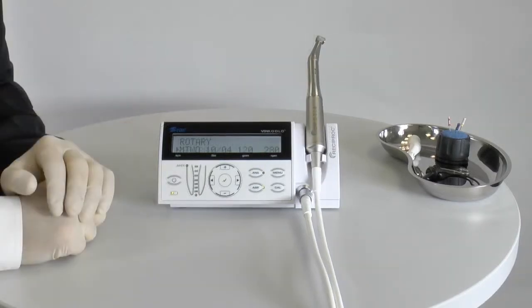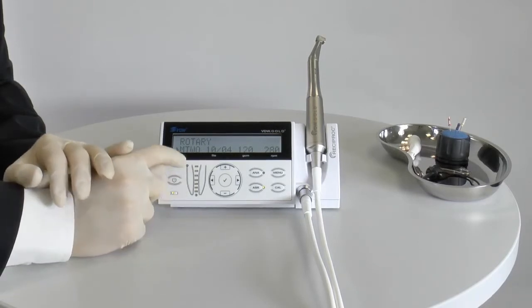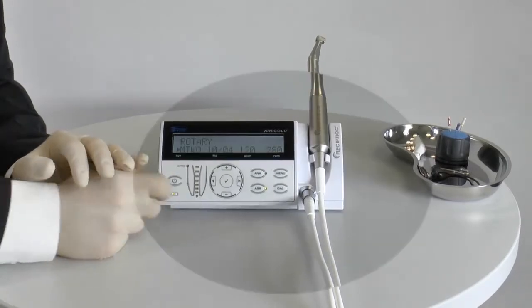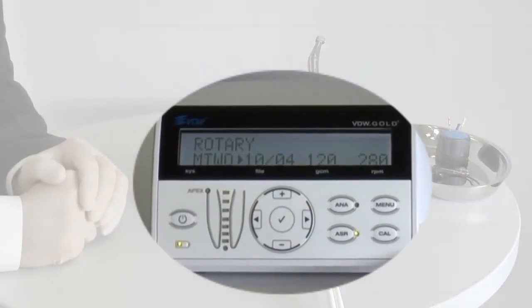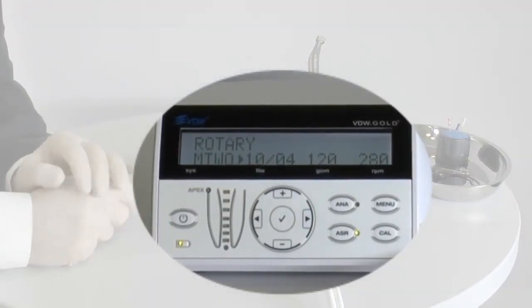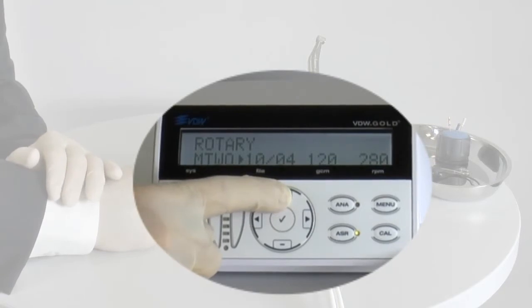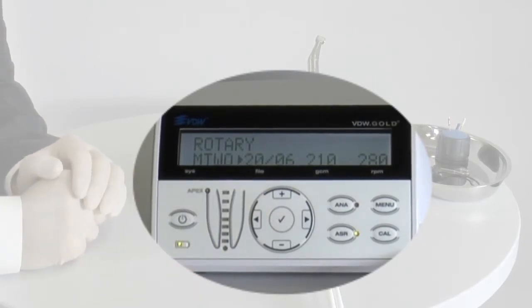If you have pre-selected a rotary file system, press the right arrow key to select the file size inserted in your contra angle. The motor then uses the correct torque value for each file size. This is important to ensure safe use of rotary file systems.